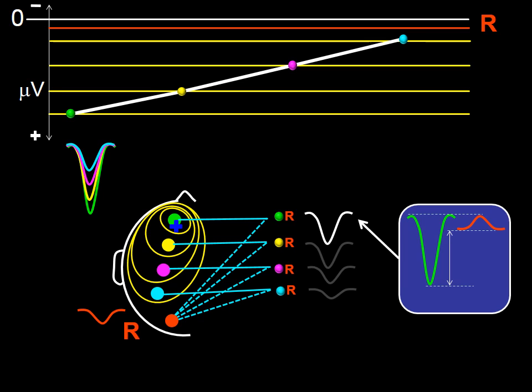The second wave is produced by the same mechanism, and as you can see, it coincides with the wave from the second derivation. So is the third and the fourth wave.